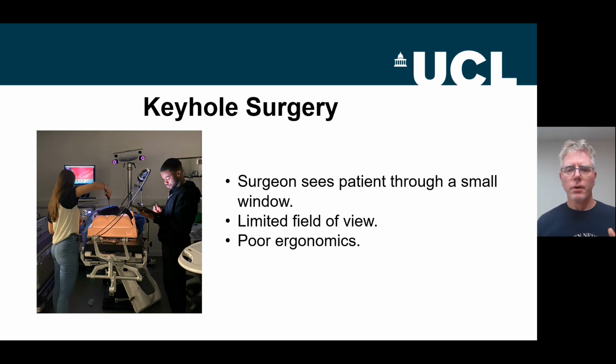So the important point is, although the incisions are smaller, so it's better for the patient, the surgeon can't see as much. They're only able to see a small amount of the patient's anatomy through a small window on a video screen. They have a limited field of view. They also have quite poor ergonomics. A skilled surgeon gets used to this, but there's still a mental load cost to trying to operate in this way.